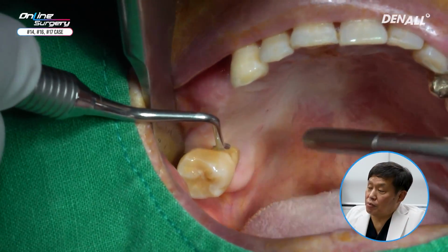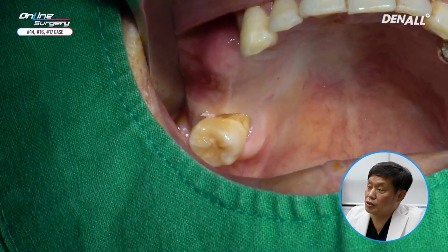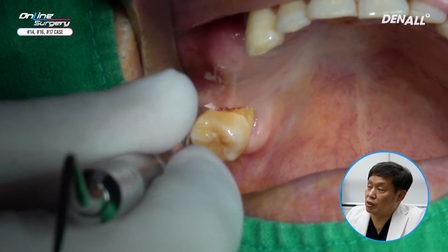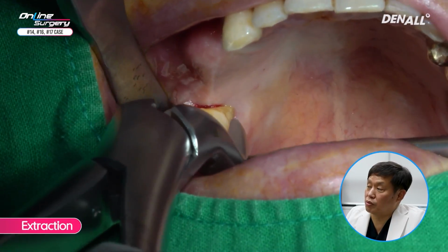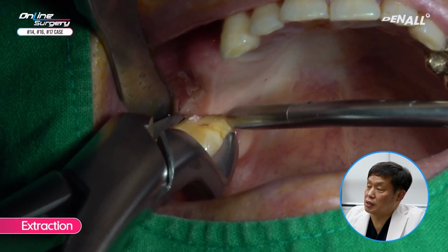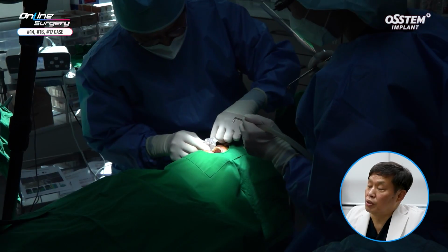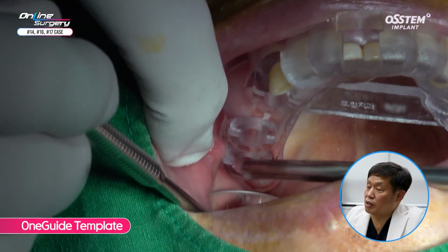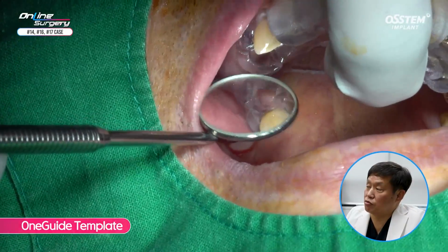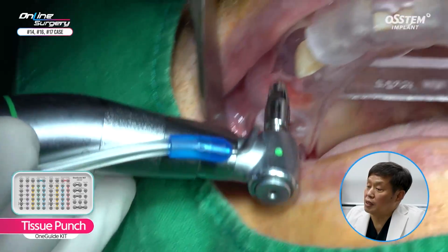First, number 8 was extracted. There's nothing special. Surgical curette was used to sever the periodontal ligament, and forceps was used for extraction. In number 17, where we wanted to place the implant, it was close to number 8. One Guide template was positioned. One Guide template was adapted very nicely.